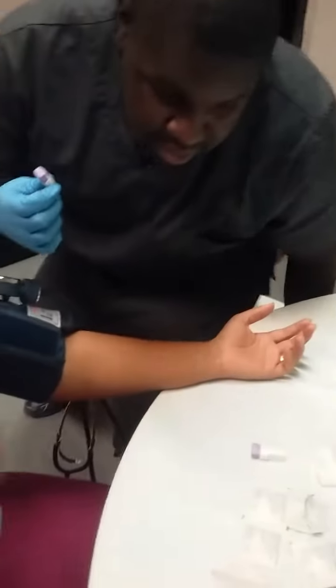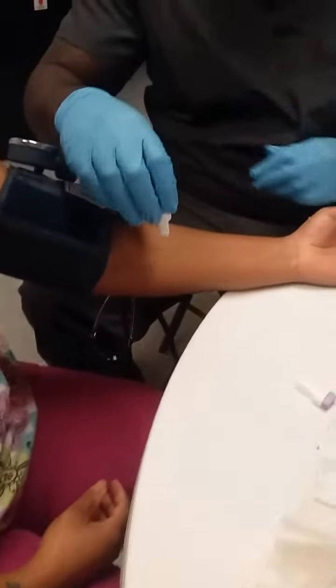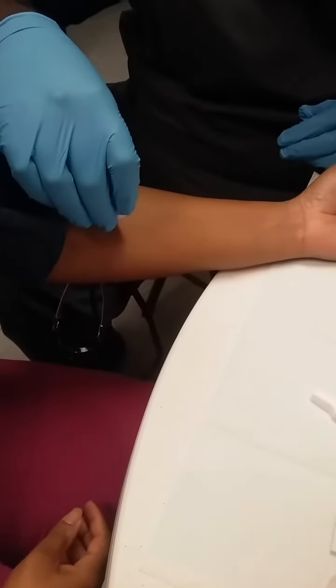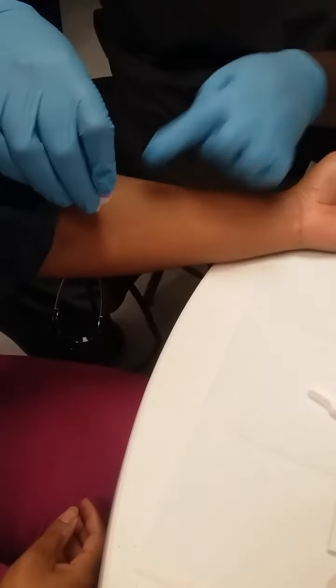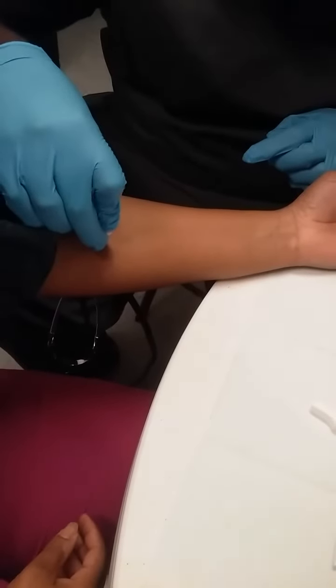Next, after we apply the blood pressure cuff, now we're ready to begin. We take our lancet, place it on the area where we want it, so this area right here, and we press down. And as you can see, it's bleeding.